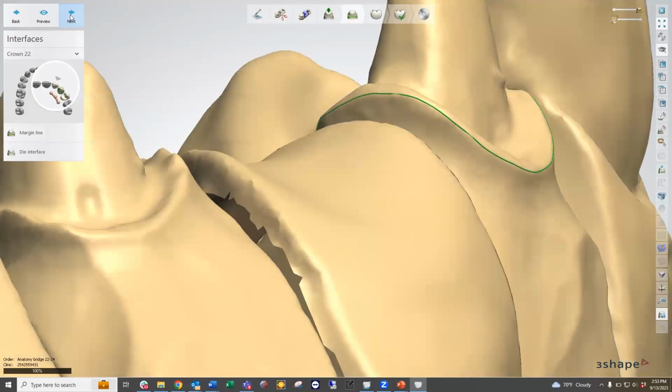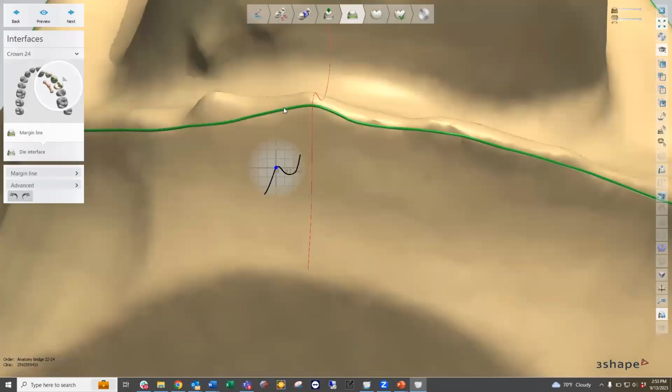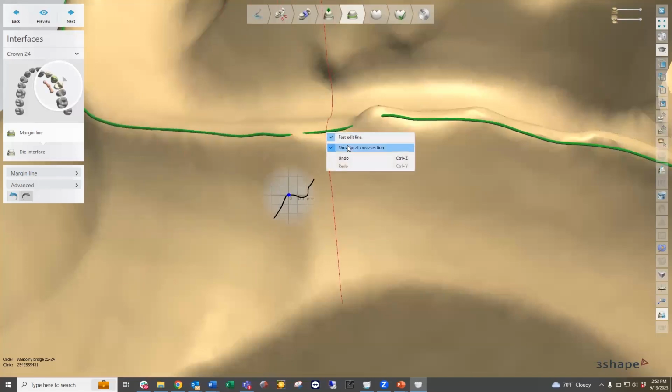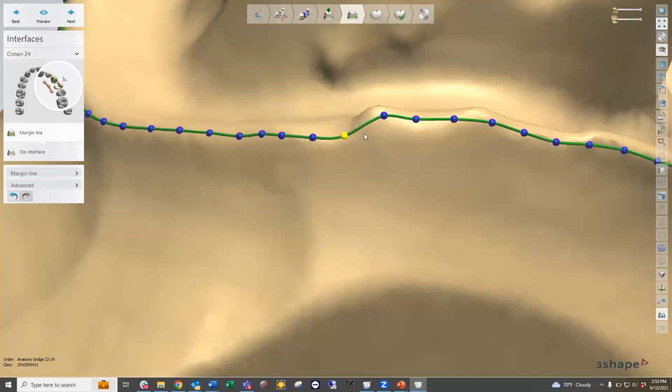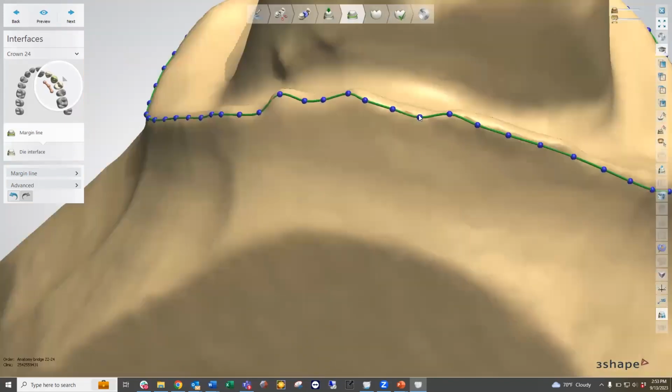Next, we're going to go into the other die's margin line. And here I have a little bit more of a wavy margin line. So I can make the subtle clicks, but sometimes that's not going to be adequate. I might have to go from a fast edit spline to the points to do that nice final sculpting of that margin line. If I need to add a point, I can go ahead and right click on that green line and add a point like we showed earlier. And this allows us to manipulate that margin line a little bit more accurately and place it however we want to.